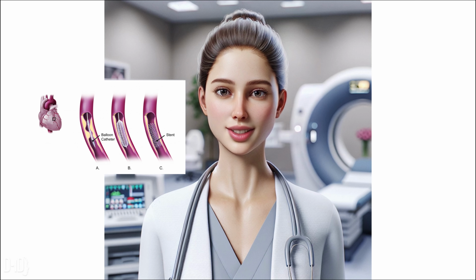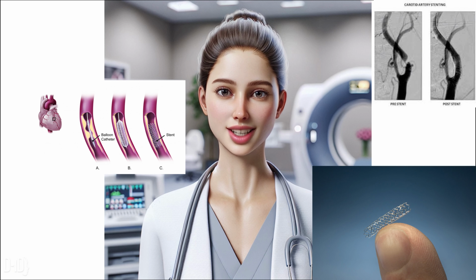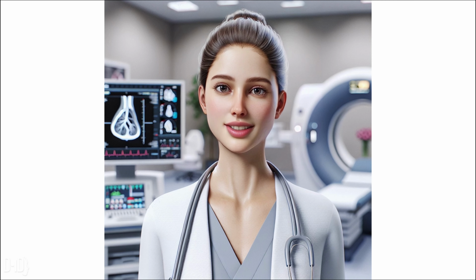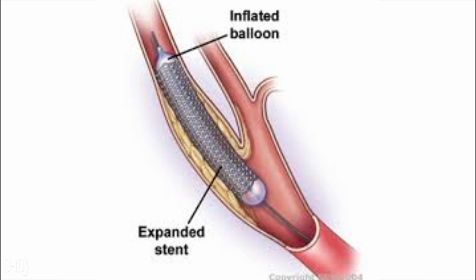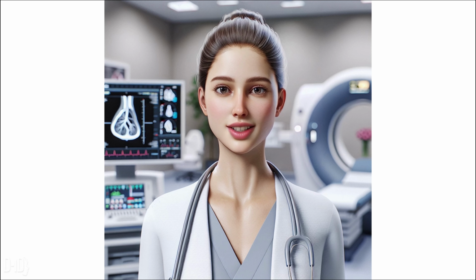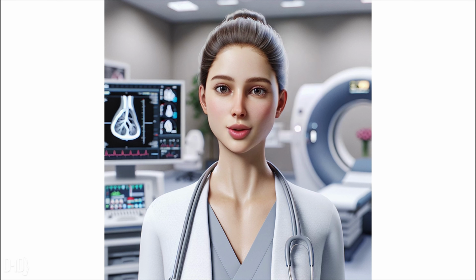A stent placement is considered if angioplasty did not obtain the acceptable range. A stent is often mounted on the balloon catheter. When the balloon is inflated, the stent expands and locks into place, providing structural support to the artery. The balloon is then deflated and removed, leaving the stent in position. Finally, the catheter is removed and the insertion site is closed using manual pressure to the access site or a closure device.